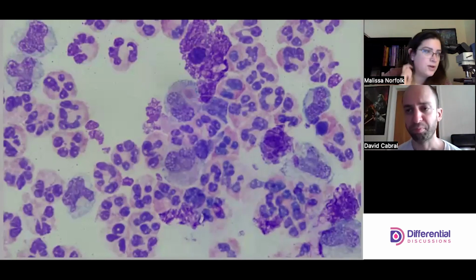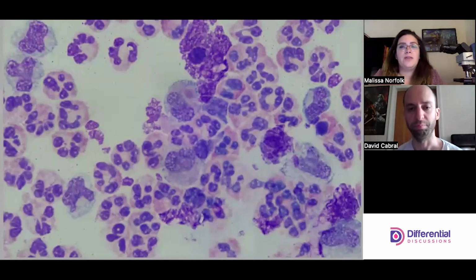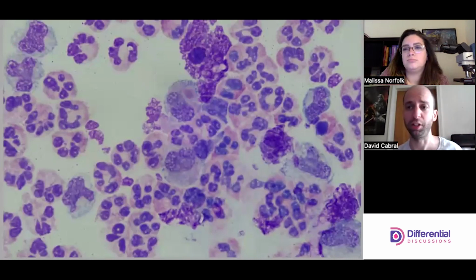So there's leucophagocytosis, which is here. And then if we had erythrophagocytosis, that would be ingestion of red cells, and that's typically after there's a bleed into whatever fluid cavity it's found in. And then when monos are just kind of ingesting junk and cleaning up, it's called necrophagocytosis. We're just cleaning up the necrotizing junk. So all cool comments in our toolbox to express to the clinician qualities about the fluid.